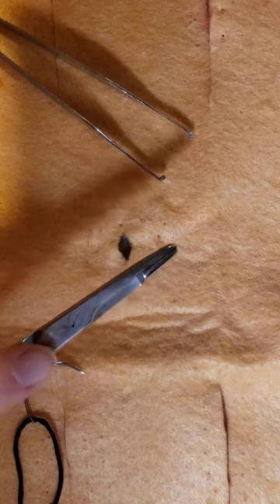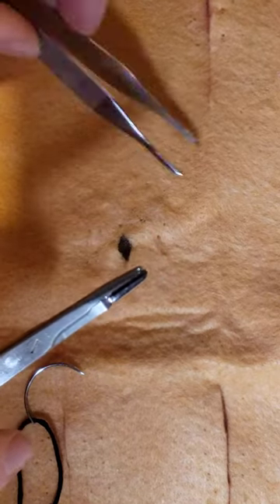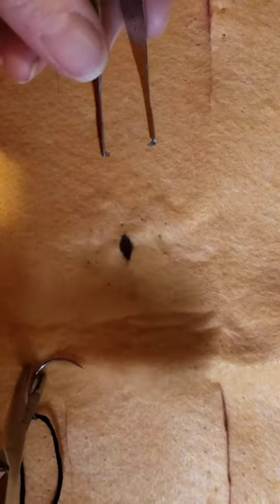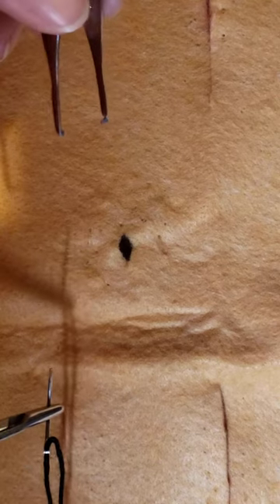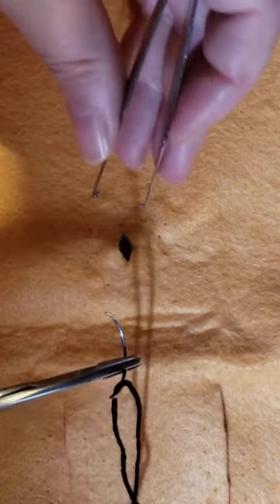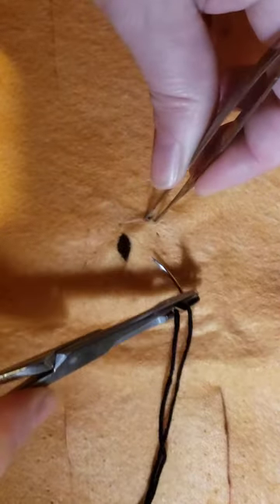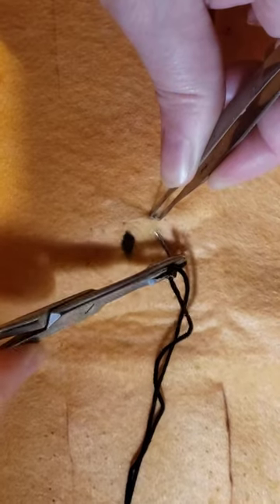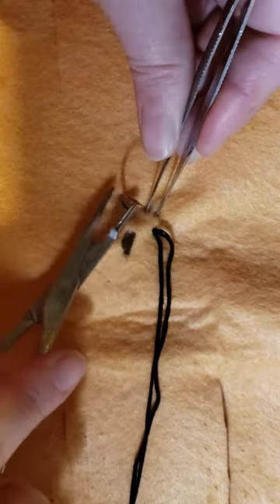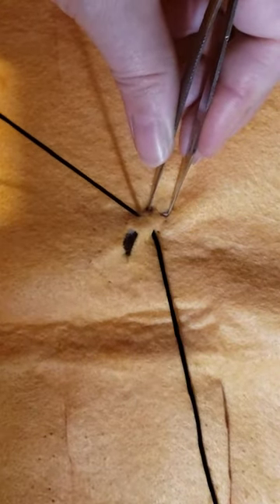So, go ahead and grasp your needle holders in your right hand and your tissue forceps in your left hand. Grasp your needle 3/4 of the way along the body of the needle and hold the needle perpendicular to your needle holders. We're going to go ahead and grasp just a portion of tissue along the edge of the opening that you're suturing. We're going to go ahead and take that bite. Leave just enough of a tail so that you will have something to tie off the other end to.